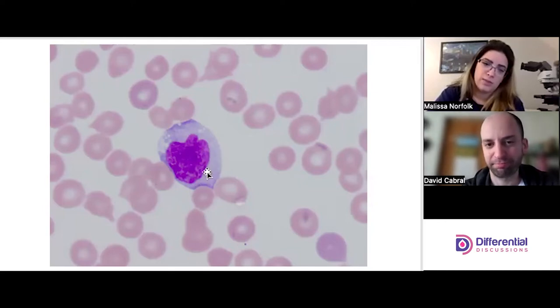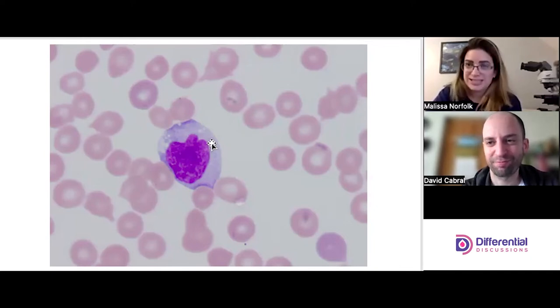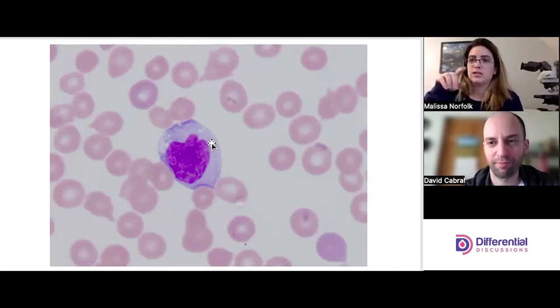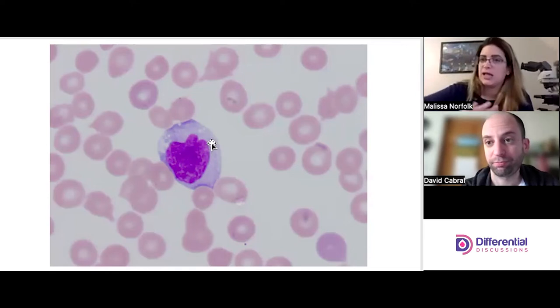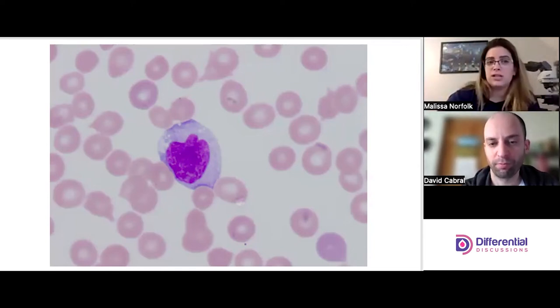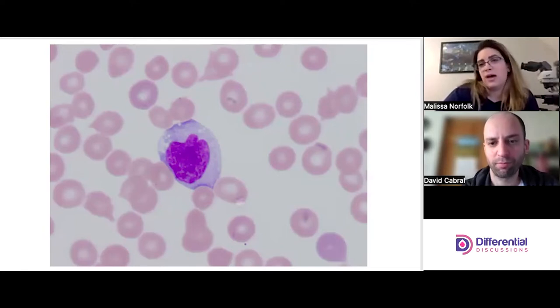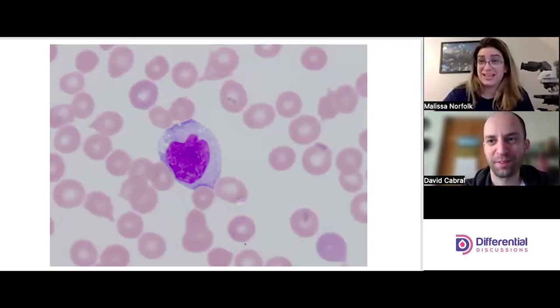When we talk about a lacy pattern, all we mean is very fine, light lines that go through — I think of them as little tiny squiggles, kind of squiggly lines that are nice and light, not super prominent. The last mono we looked at had more prominent white striations, but it just depends on the pattern. This one is more mono, but see — this is why these are tricky. They can really look reactive.